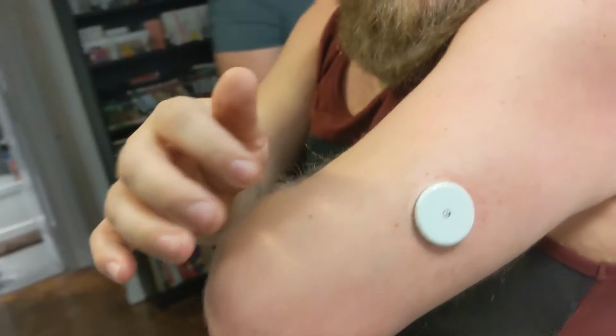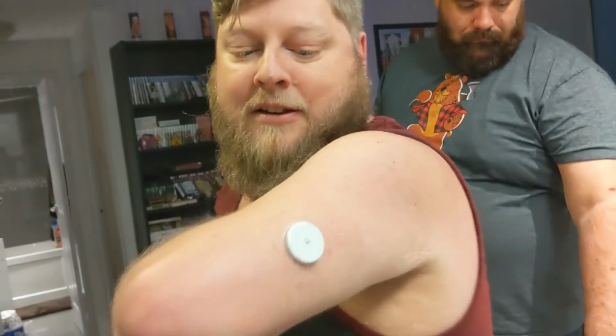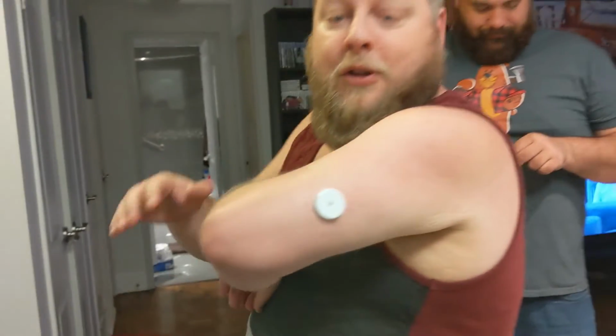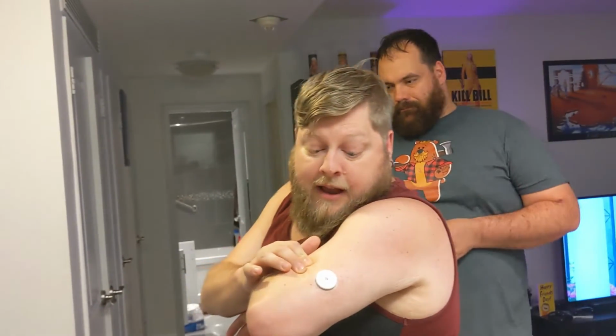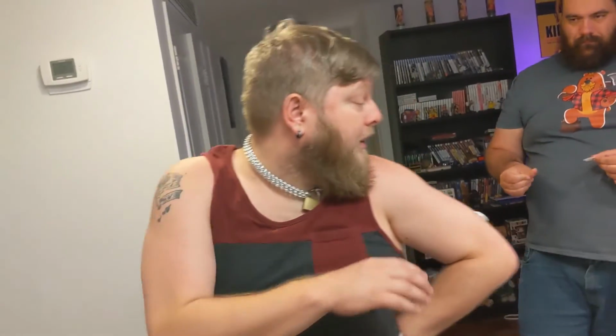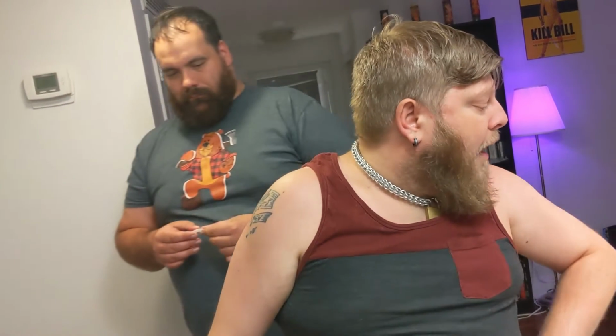Now, one other thing I'll mention, because it's happened to me before. If you start to get a little blood coming out from the top or from the sides, it's not the end of the world. It sometimes will look bad, because one time I remember we did this and I started bleeding from the top of the sensor. But as long as the bleeding stops, you've got nothing to worry about. So far so good. It actually looks like it's sticking really, really well, compared to the last couple of sensors.